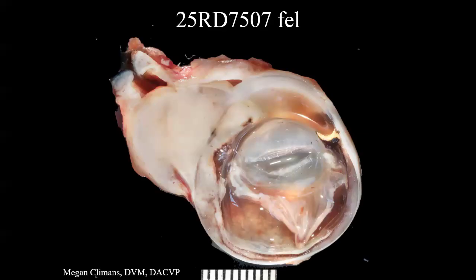Oh, sorry. This is a cat. Again, we have an 8-year-old spayed female Maine Coon. This cat showed, they described buphthalmia, and a swelling or mass at the 11 to 5 o'clock position, with dyscoria, so weird pupil shape. Grossly, we saw a mass that was protruding through the episclera and into the bulbar conjunctiva. You can see the eyelids displaced over here.